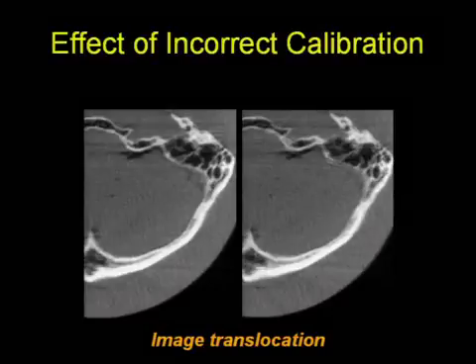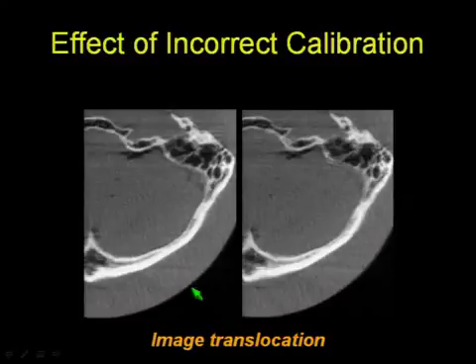Okay, well, you can see that there's a little bit of a blur, especially in the fine elements of the image. This is because the motions that we're trying to correct are of the order of a few millimeters, so objects that are of the size of a few millimeters tend to be more blurry.